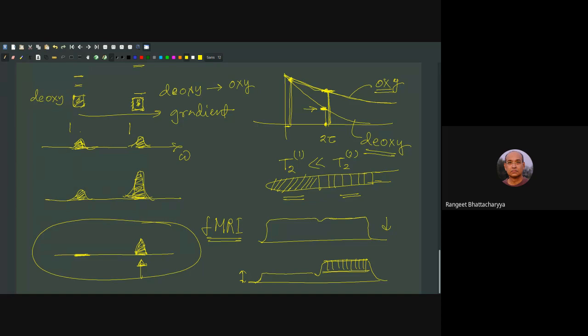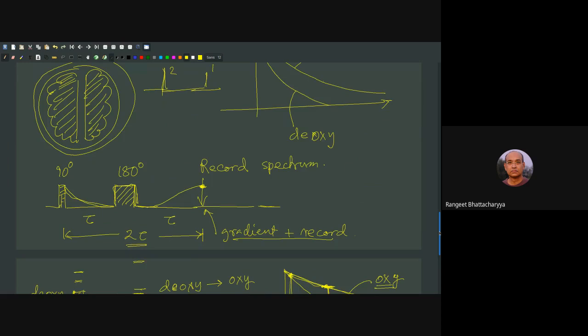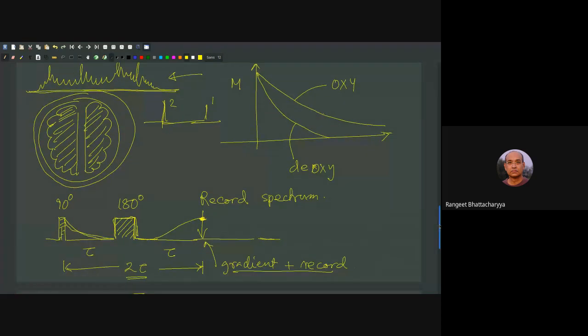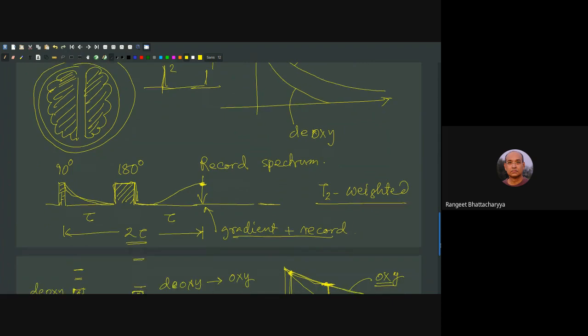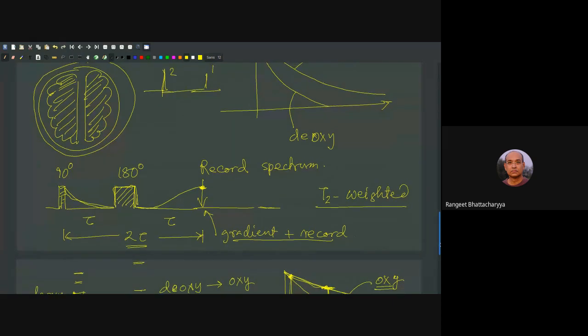Okay, so this is the bold response technique. To summarize, what does the bold response technique depend on? First, you have to do a spin echo sequence. Why you need that? Because you need everything to be T2 weighted. The word is T2. You'd like to weight your image by T2. So that means higher T2, one weightage, lower T2, some other weightage.